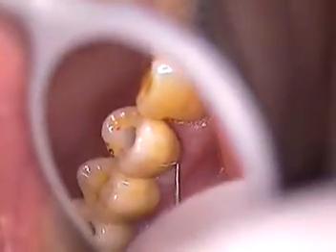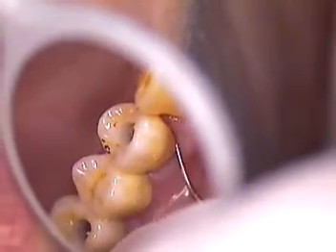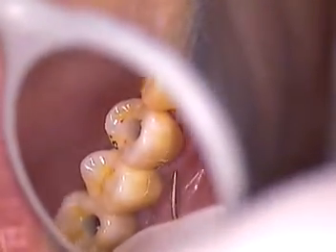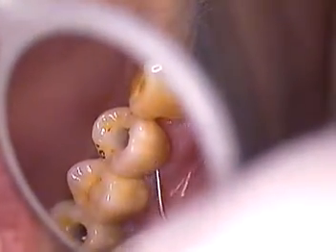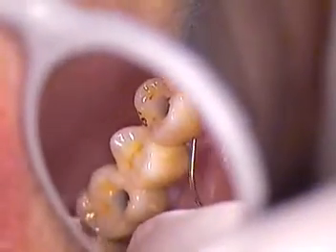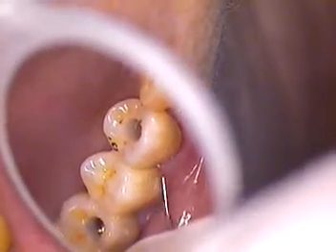Minimal blanching here. For those of you who have just tuned in, please take a look at some of our other videos related to bone-level impressions. You'll see how we make it a very simple, step-by-step approach that allows us to go from the impression phase all the way to the final without adjusting.